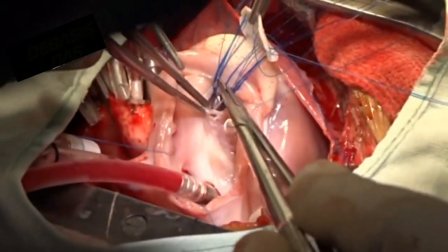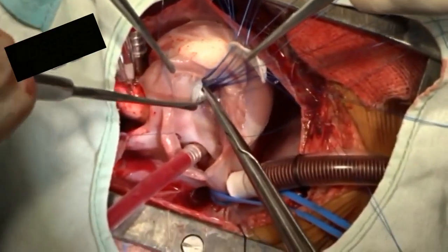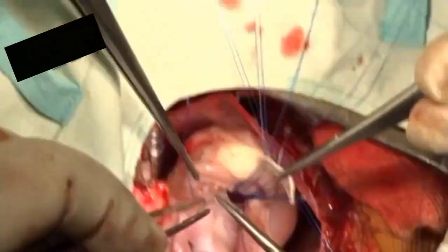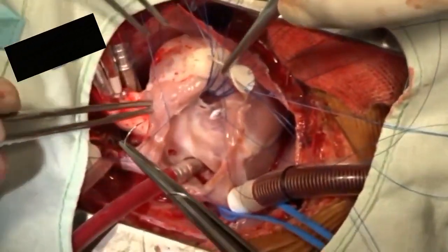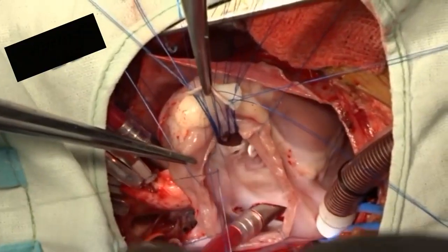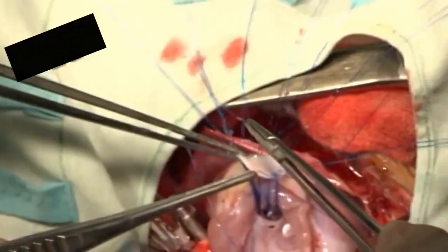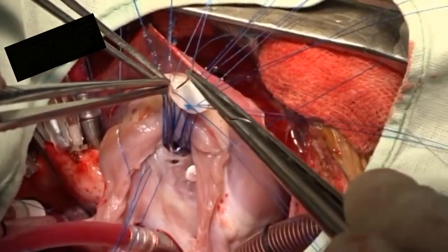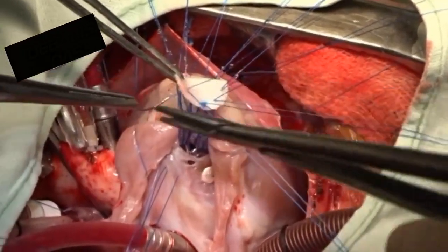In our technique of VSD closure, the tricuspid inlet portion of the VSD is closed with outside-in sutures through the patch, through the tricuspid annulus, and then the needle is passed through a pericardial strip which is still attached at this stage and will be subsequently detached.